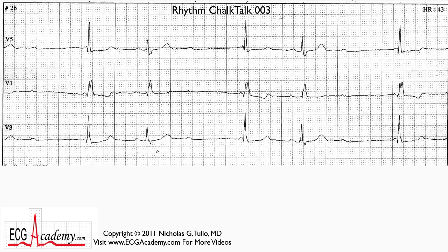Let's get to this. Remember to look at the forest. The first thing I see is that the QRSs are irregular. Look for a pattern — it turns out that these are regularly irregular with a group of two, and then a little pause, and then another group of two. And there's another QRS out here, and you might think there might be a group of two, but you don't know for sure.